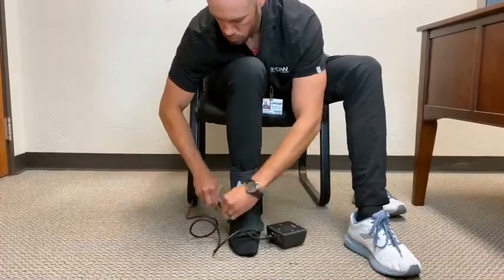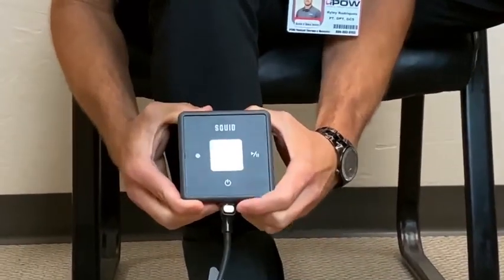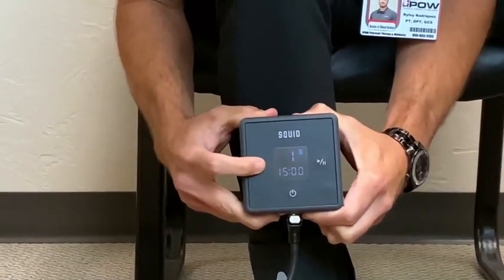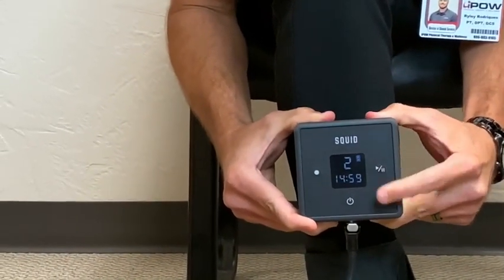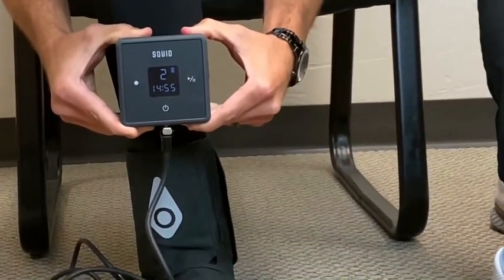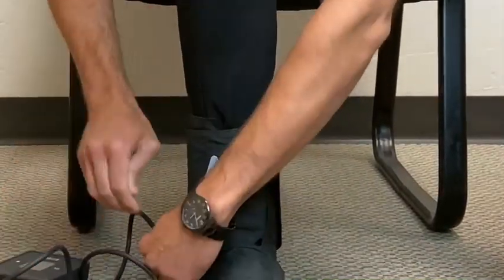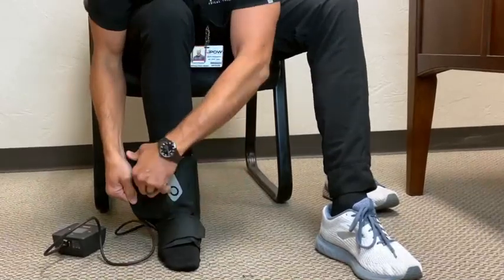Attach the connector tube to the pump and wrap. Turn on the Squid Go control unit. Select compression level by using the white dot. Start treatment by long pressing the start button. Full treatment lasts 15 minutes. You can see the treatment progression on the display. The unit will turn off automatically at the end of the treatment. When finished, remove the wrap and place the gel pack in the freezer.